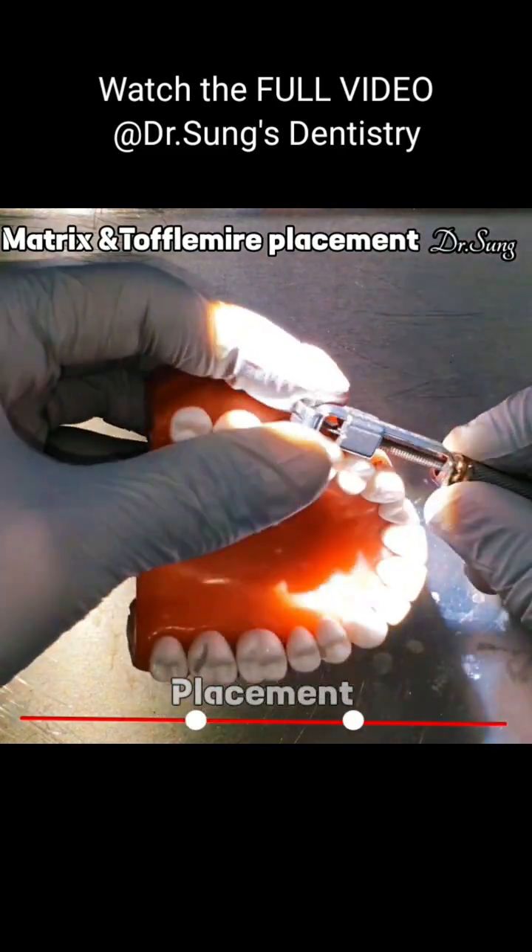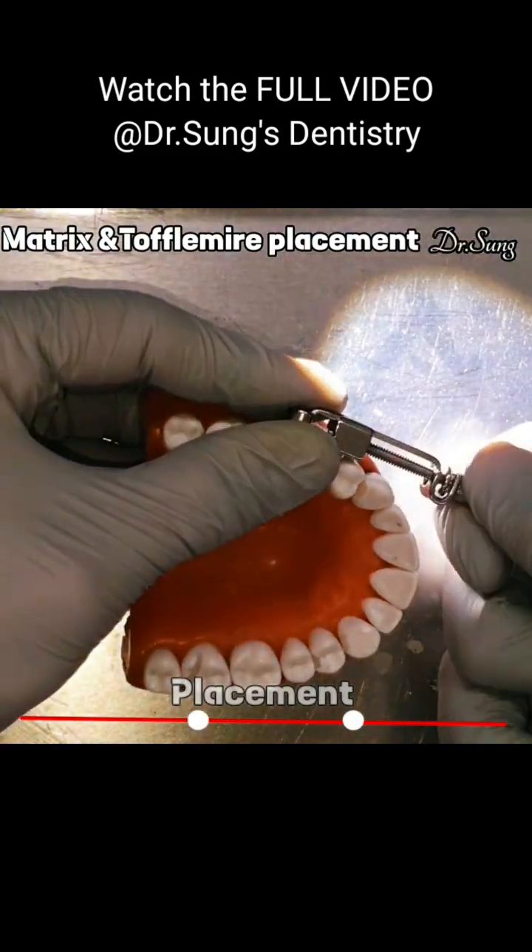Pull the matrix band — and can you get the orange wedge?